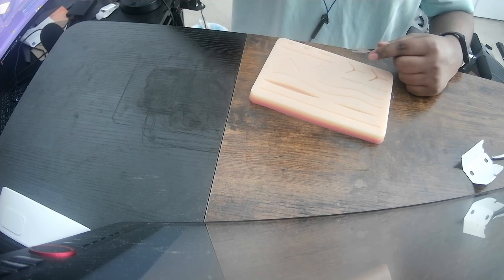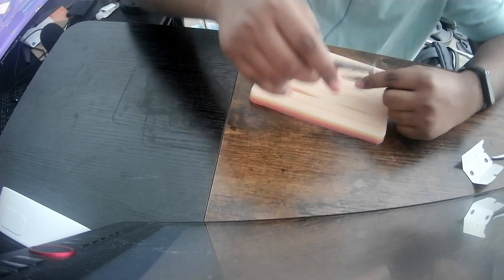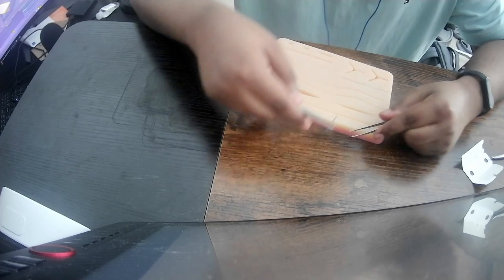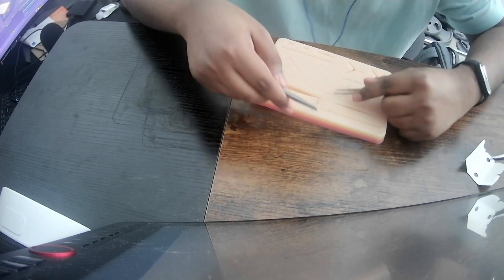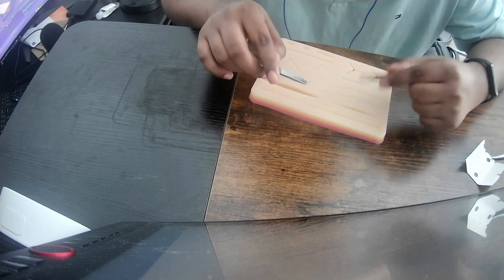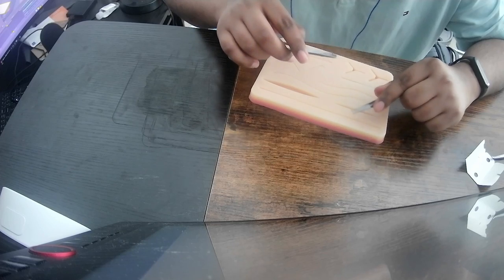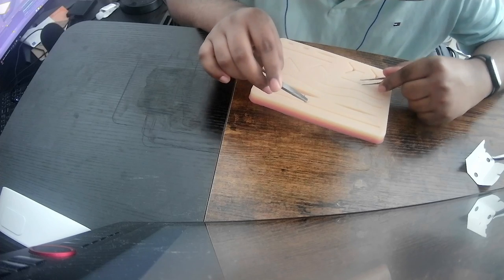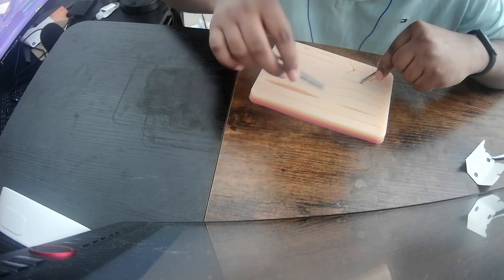Okay. Get that loaded and then reload on this side. And now the issue is there's a lot of suture that's slack and it's getting in my way. I hope I don't mess up. How do people do this? Holy shit. Okay. Let's see. Okay.